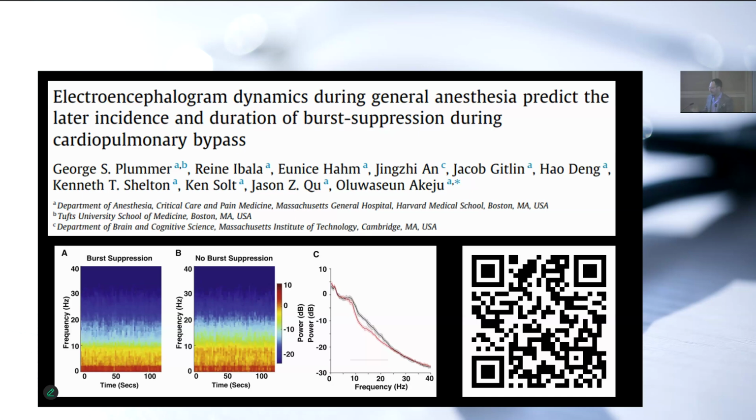The observation was that badness is associated with high incidence of burst suppression and longer episodes of burst suppression. The notion was, can you distinguish the groups of patients that get this versus those that don't? The idea is that a neurophysiological distinction would strongly suggest that patients that exhibit burst suppression have some sort of unique, actual biological predisposition that should be manifest in their EEG before they have burst suppression. It's a great idea, actually.